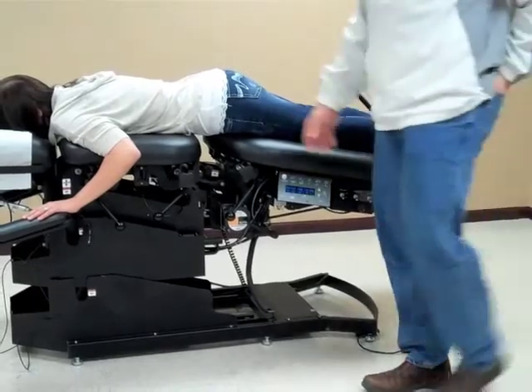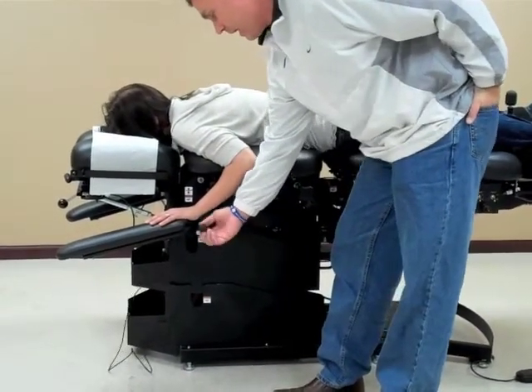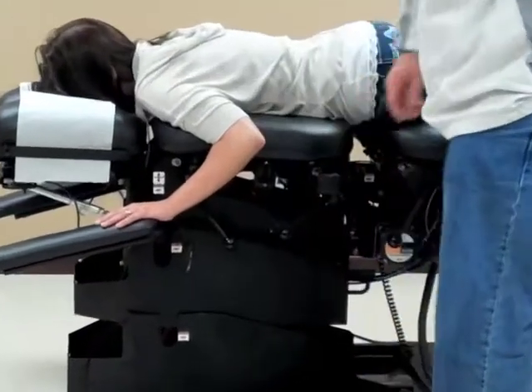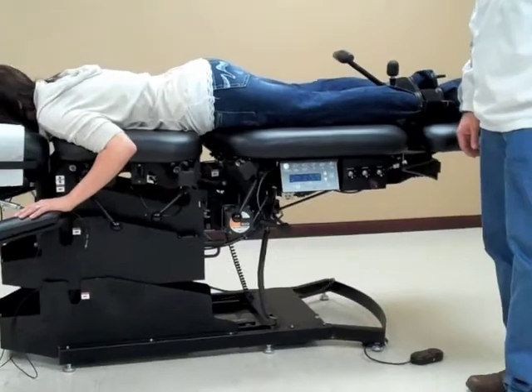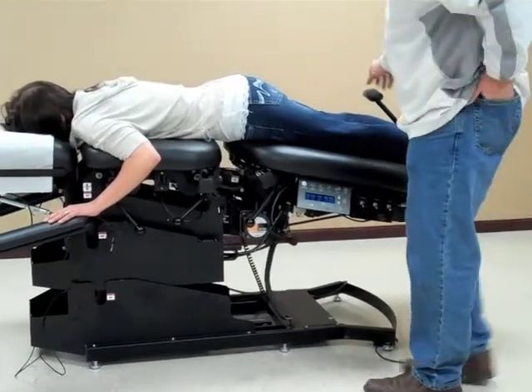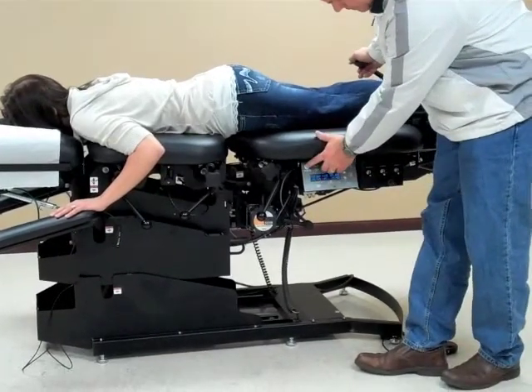Now, if I was to leave the room, we have the automatic stop switch here for the patient to push if she wanted to stop the table. To stop the table, I'm just going to hit the start-stop switch here.